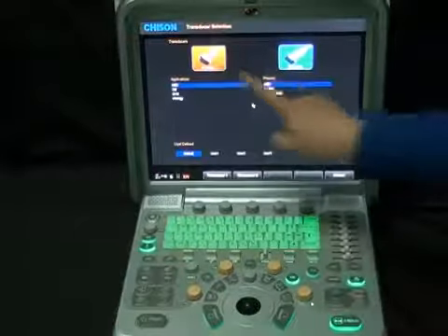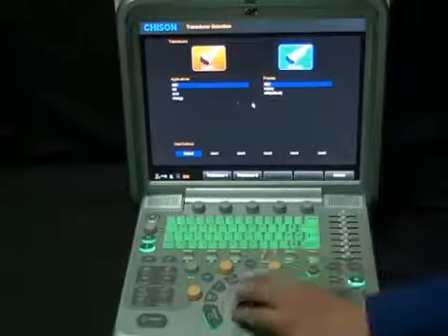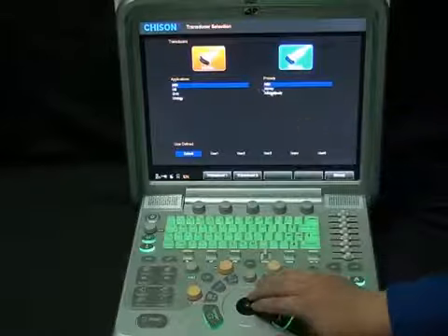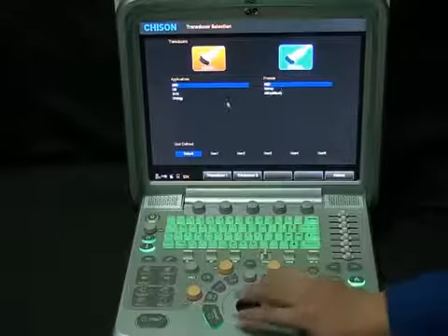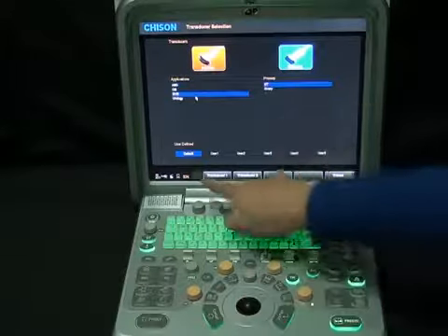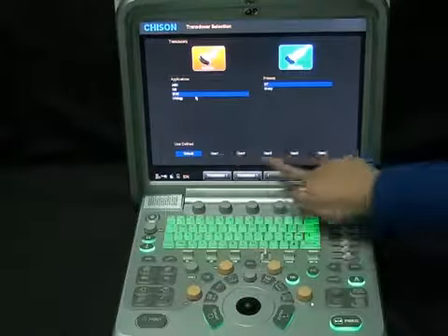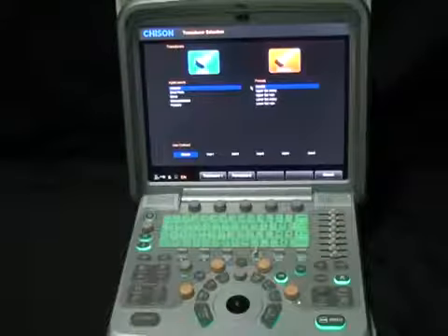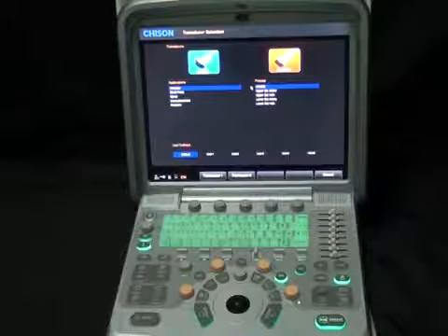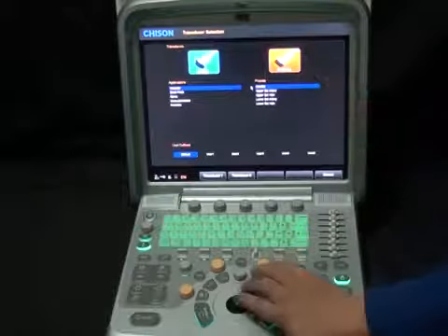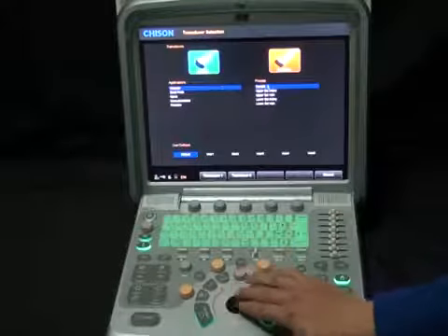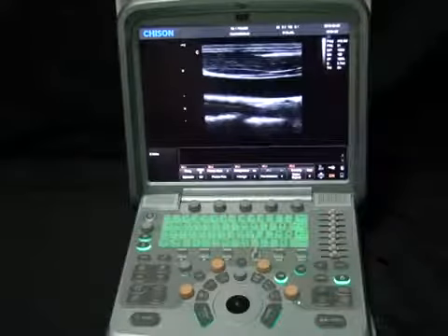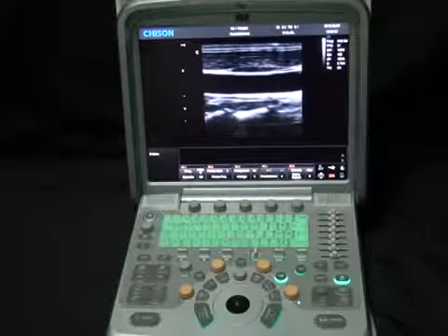This is the main exam screen. Two probes are available; each probe has several applications, and each application has several presets. This is also where custom presets are shown. We are going to choose the linear probe, vascular application, and carotid preset. Double-click carotid to enter the scanning interface.